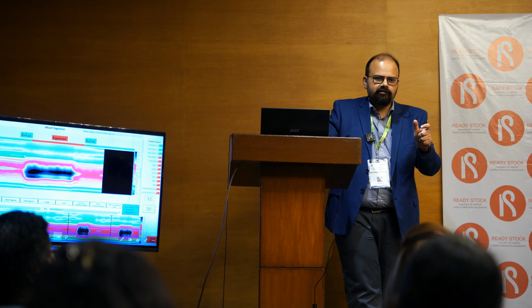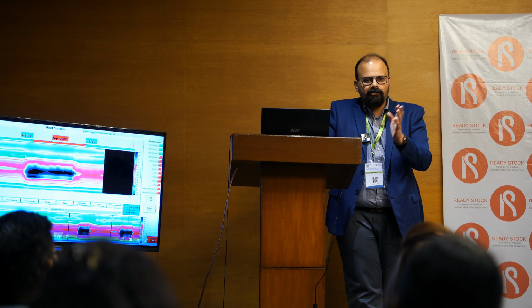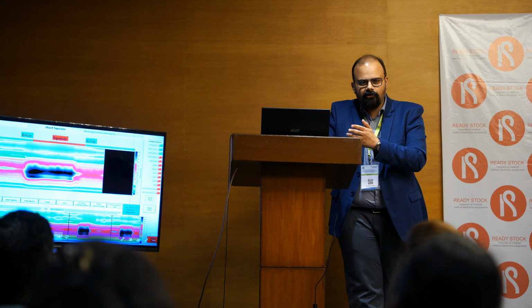Why you wait for 30 seconds is because once you've taken a swallow, the next swallow, the DCI, will be less if you do it too fast. Same here. If you take squeezes too fast, you will possibly not get a truer value. So ideally wait, but if it's something which is very clear or normal, you may do it faster. So 3 squeezes is what we all want, ideally.